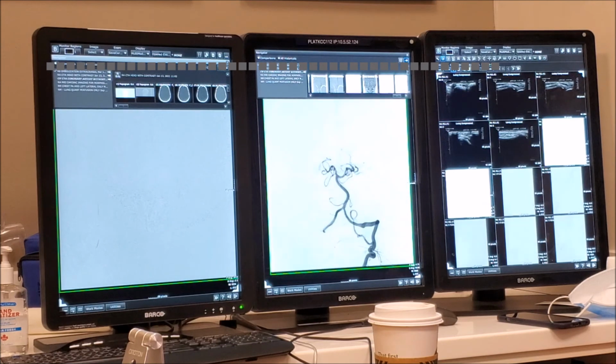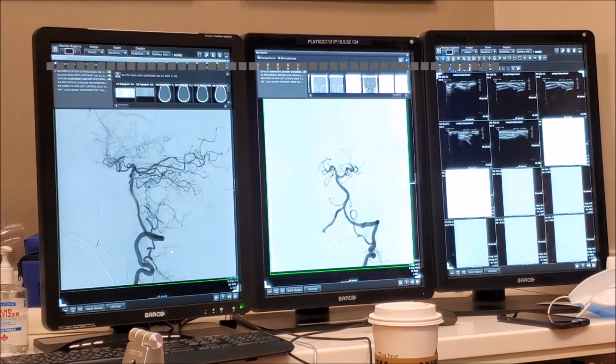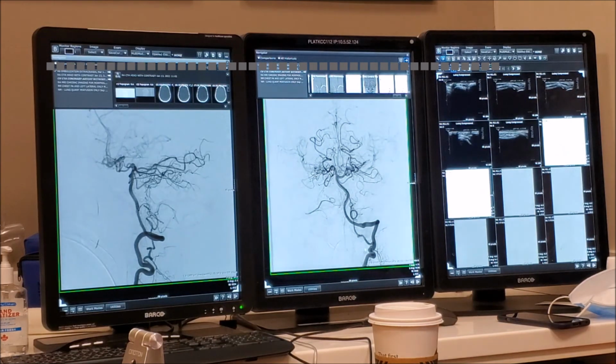It is, great case. Okay, there's PICA. We found PICA. It's a very low origin, C2. This is PICA. You see how it follows parallel to that, but this is PICA. This is a low origin of PICA. Okay, that's why this was so small. So we found the balance.